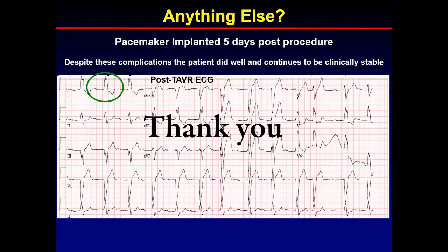Right, so one interesting situation we had was where, during a TAVR, the assessment of the TAVR on CT was fine, except that the patient had a pheochromocytoma. So that would not have been about longevity of living post-TAVR or pre-TAVR. It was actually going to impact the procedure itself if the patient had a true pheochromocytoma.